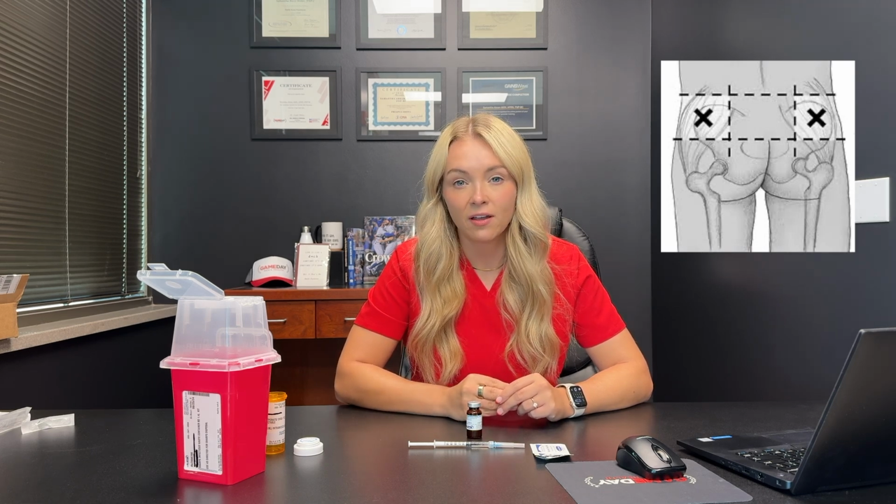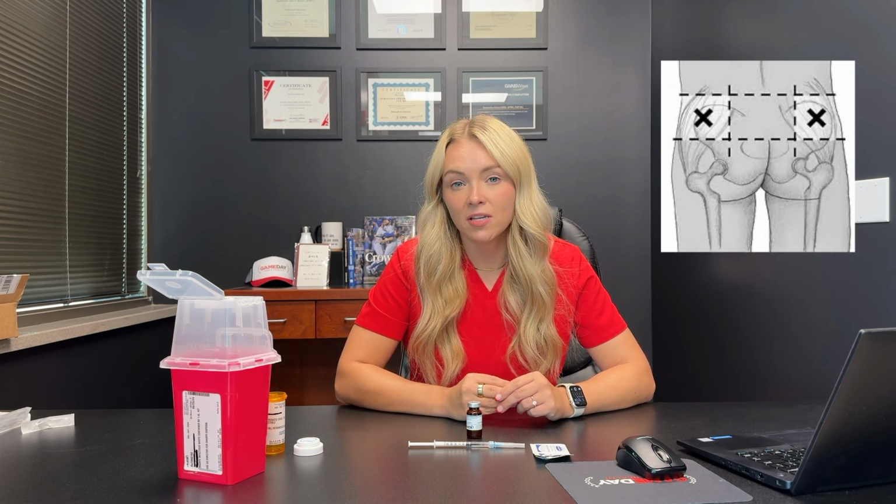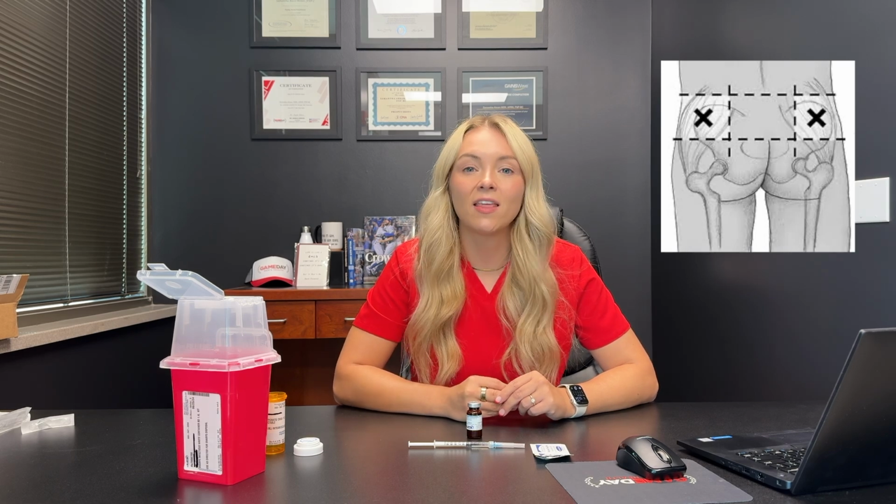Next, we're going to prepare our site for injection. To do this, we're going to imagine the glute split into 4 quadrants. So a line going top to bottom and a line going left to right. Your injection site is going to be the top outer quadrant of that square. So on the right glute, it's going to be the outer right top quadrant. And then on the left side, it's going to be the outer left top quadrant.